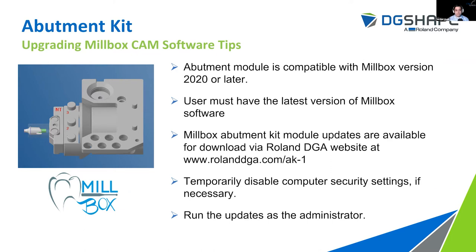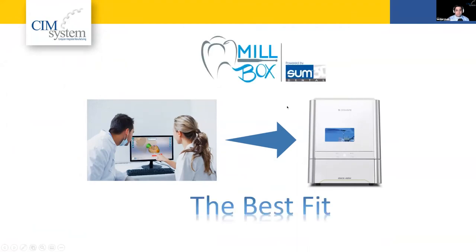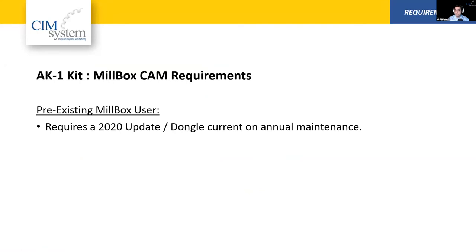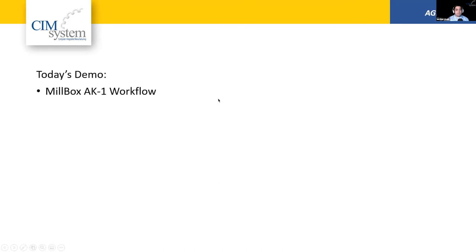In today's demo we are going to talk about the AK1 workflow. We're going to start by selecting a new job, where we tell the software what kit or system we're using — whether that's Medentica, NT Trading, or GeoMedi. The second step is to import our custom designed abutment from 3Shape, ExoCAD, or Dental Wings. From there we select the blank. If you have automated functionality set up, this step is actually optional. Otherwise you would simply select the blank code from your implant catalog guide and the CAM software will automatically align your design with the implant blank.